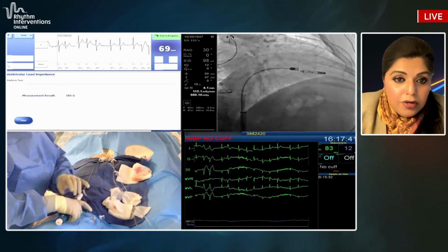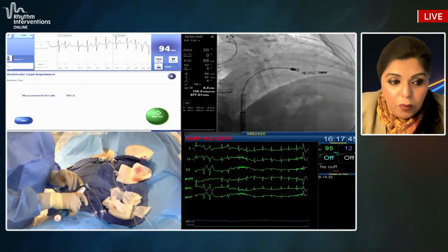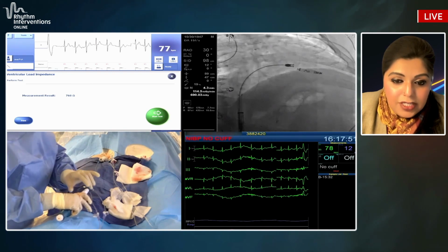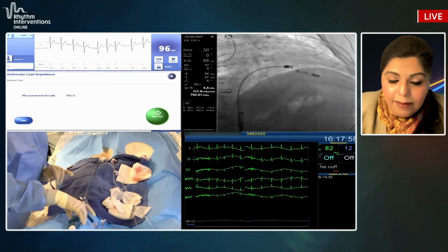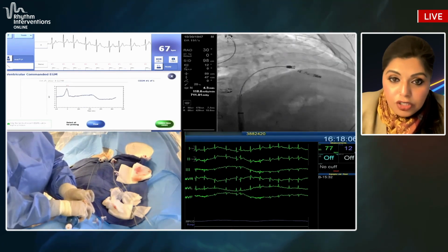mode. And the tether mode is where you brace that blue knob and you move the white handle back towards the feet of the patient. So this is what we call the tether mode. And once the tether mode is in place, you can actually watch the device to make sure that the device is moving with the cardiac cycle. You can establish kind of an anatomical reference of the helix's range of motion.